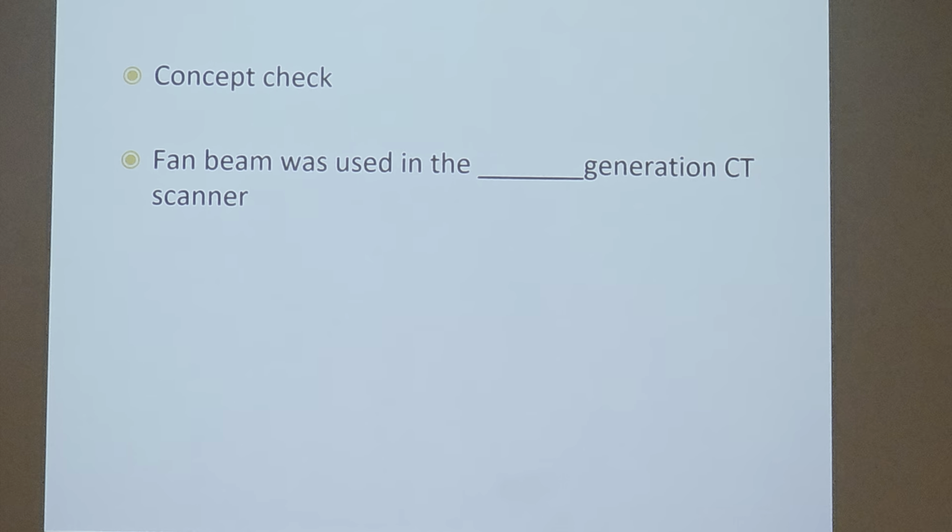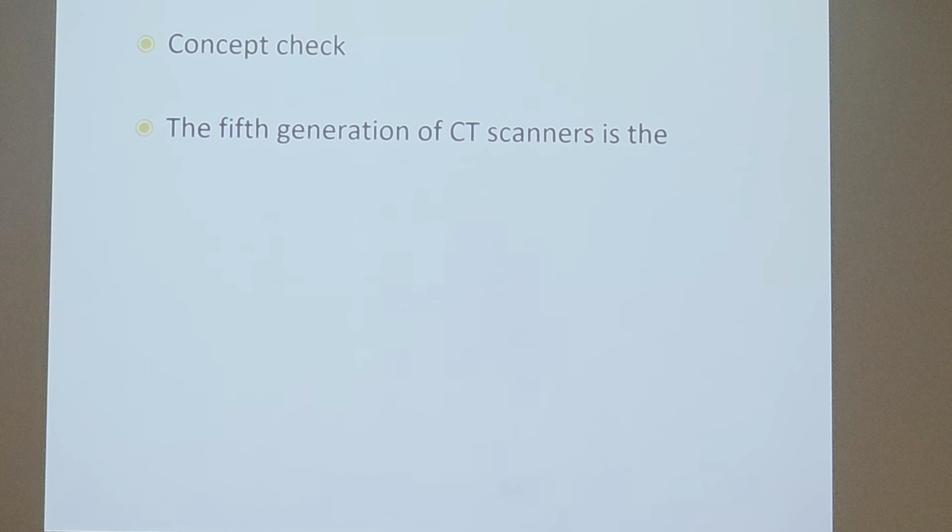All right. Alexis, I'm coming to you. The fan beam was used in the blank generation CT scanner, is she right? Everybody's nodding their head in support. Perfect. You see, you guys are learning. I'm excited about that. Or did y'all look up all the answers? Y'all just scrolled up on the PowerPoints right now, because all of these answers are there. Fifth generation of CT scanner is what? What is that called? Electron beam. Very good. That's it. You guys passed.